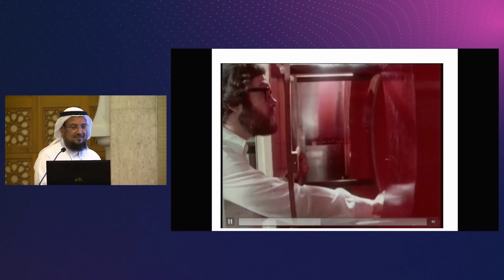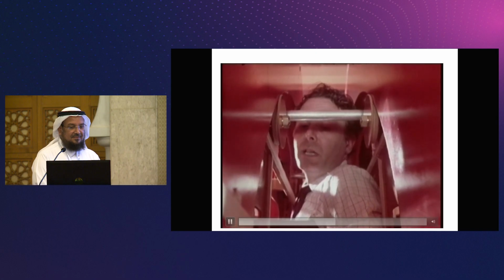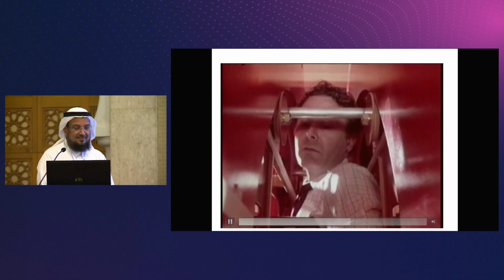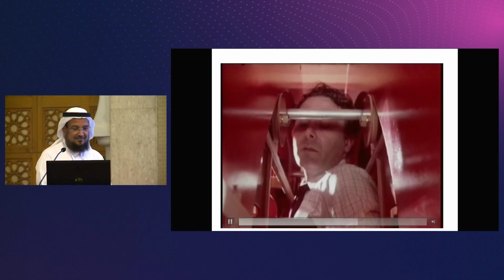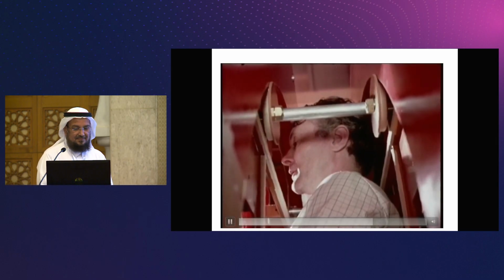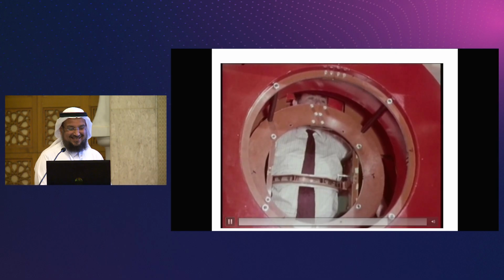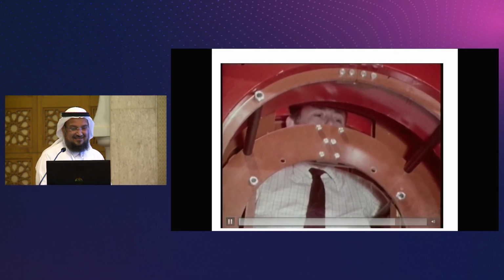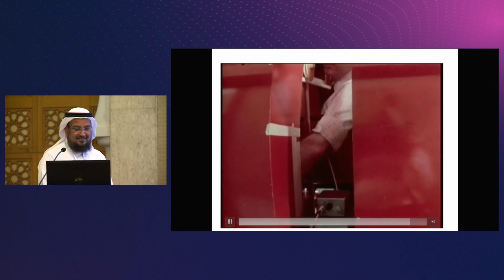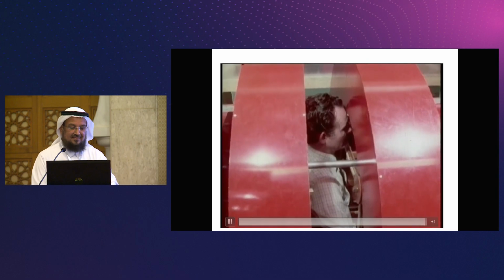In new experiments of this type, one can never be 100% sure that there won't be any adverse effects. The worst thing that could have happened would be a cardiac arrest, so that when the button was pressed, I would have either had an immediate cardiac arrest. If that didn't happen, then I was fairly certain that things were okay. Yeah, that's fine. Now are you ready to go? Yes, I'm ready to start. Fine, okay, then press the switch and let's go. Okay. This is the computer they were using. Dr. Mansfield feels nothing. The machine consists of 4 large electromagnets. They produce a huge magnetic field which passes right through the body. At the target area, there's a smaller, separate magnetic field which is used as a 3-dimensional.